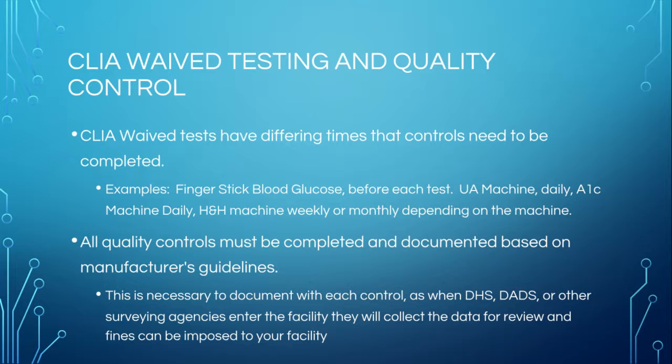They can take away the doctor's ability to do any kind of testing. Those are all things that can happen. So it's really important that quality controls are done based on industry standards and based on the manufacturer's directions. And also based on your policy and procedure.